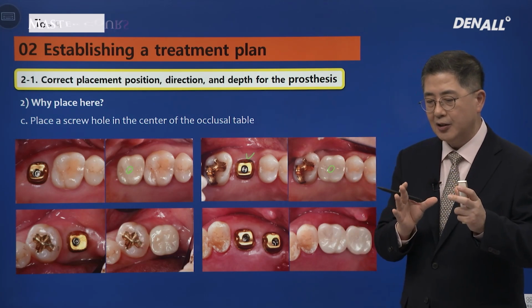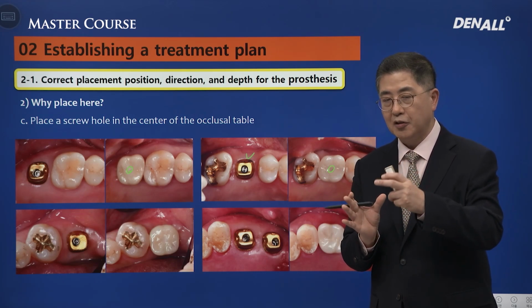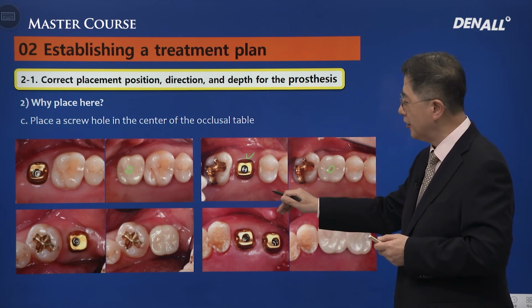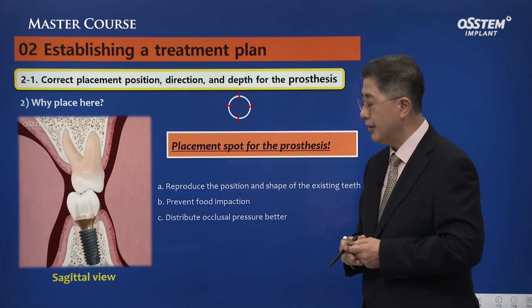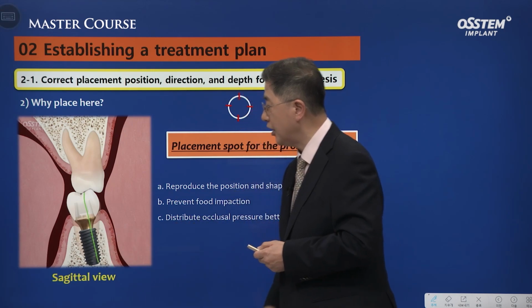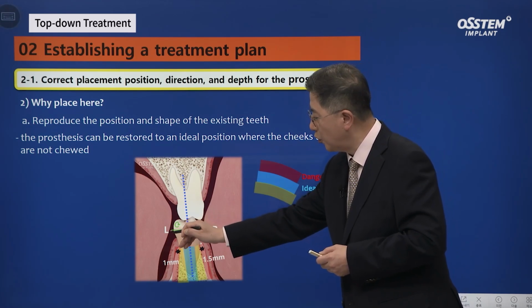Regarding implant placement timing, we need to make a correct decision so that although there is slight bone formation within the socket, the buccal bone may not have resorbed. From sagittal view, the implant position should mimic the natural tooth's axis, but it should avoid excessive lingual inclination, especially in the mandible.